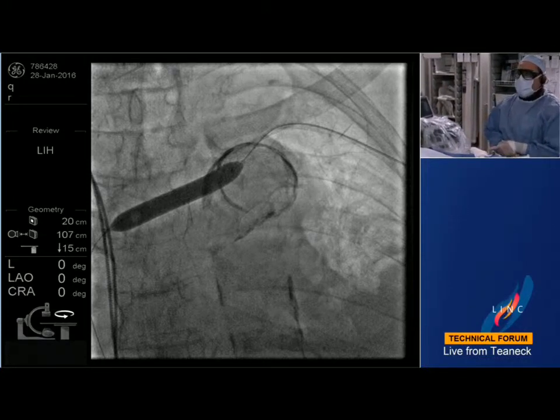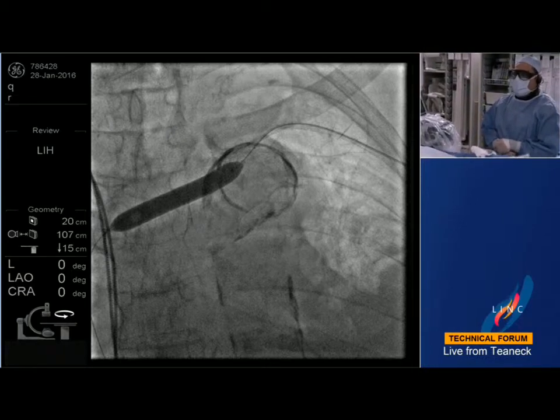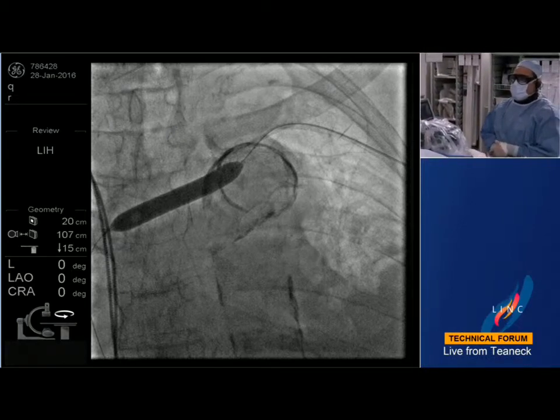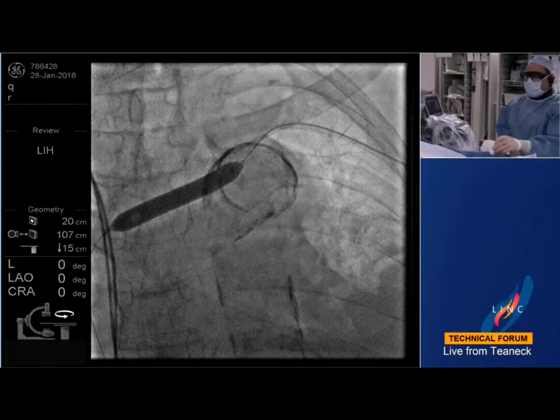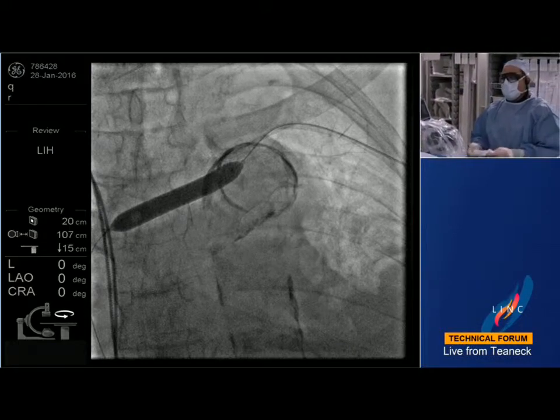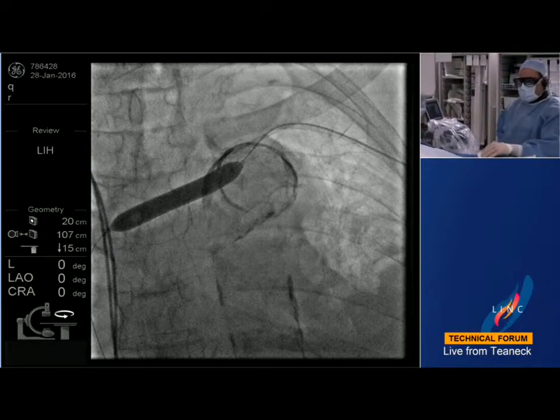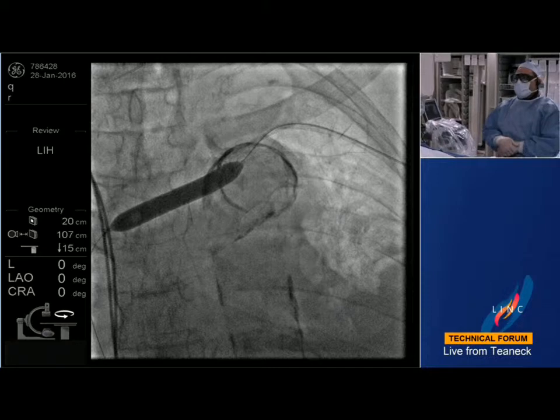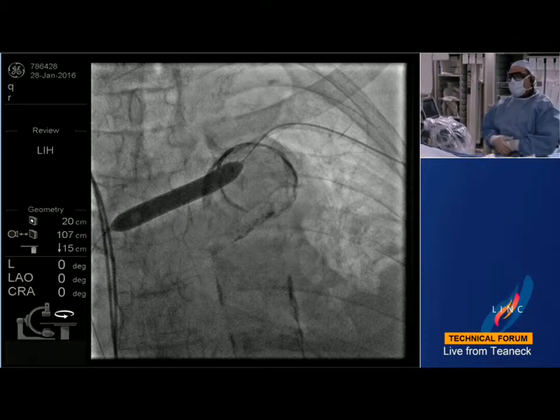Now, this is the first time that we're seeing this central venous lesion out of all the previous studies this patient has had. So it was a little bit unexpected finding as we were reviewing and preparing the cases. And given that his arm is a little bit swollen, like we said, we're going to go ahead and treat that to prevent further swelling.